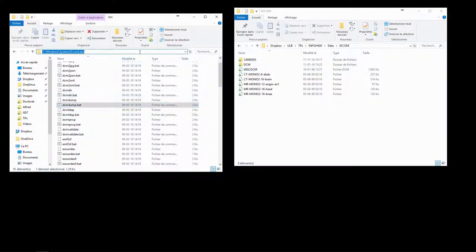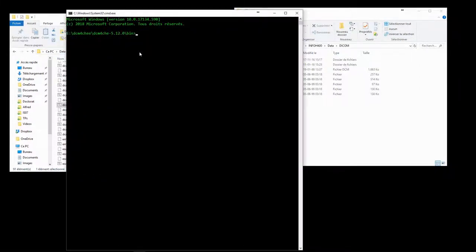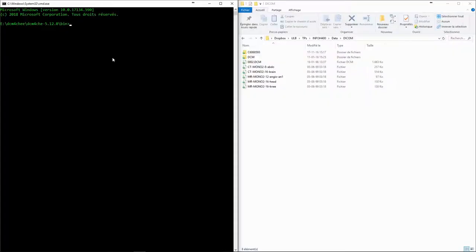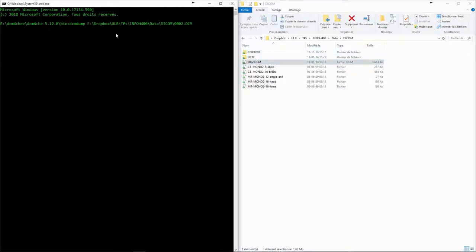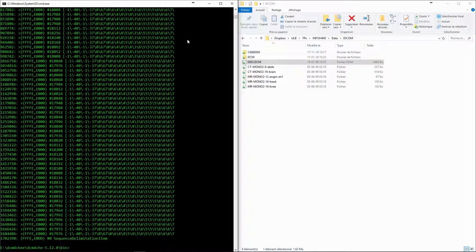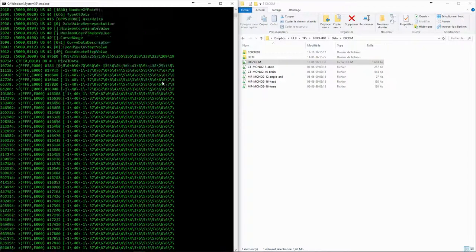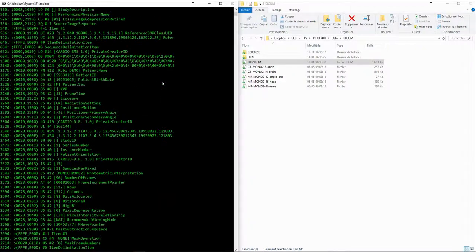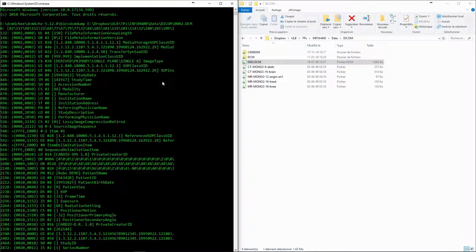Let's start a command line prompt from the binary folder of DCM4CHE. We use the DCMDump command on the sample DICOM file that we already opened earlier. We see the entire content of the file dumped on the command line, which corresponds to a DICOM tag within the file.